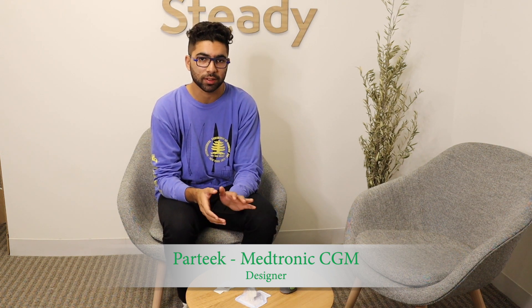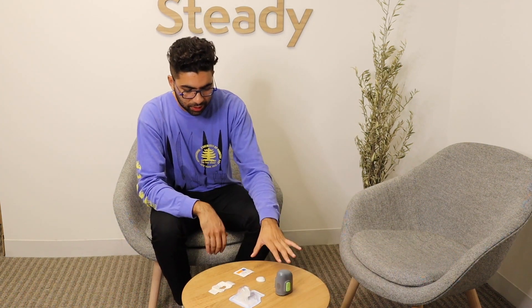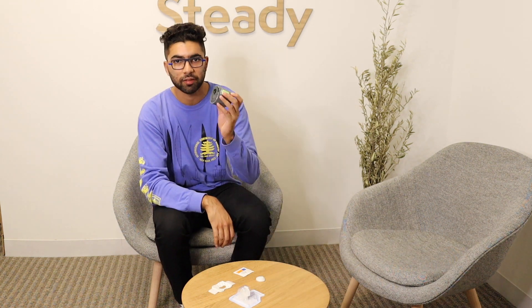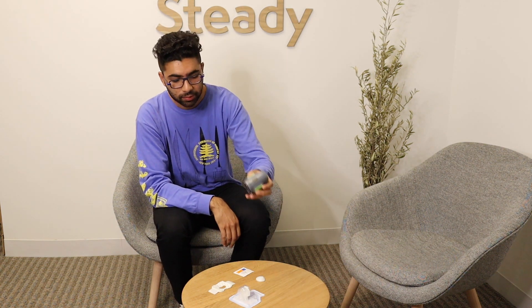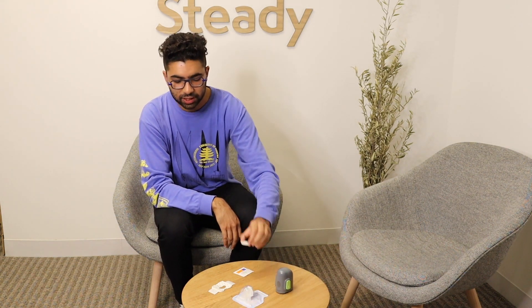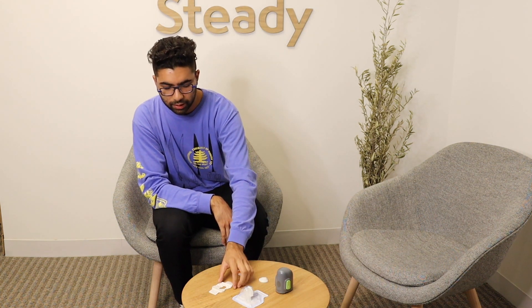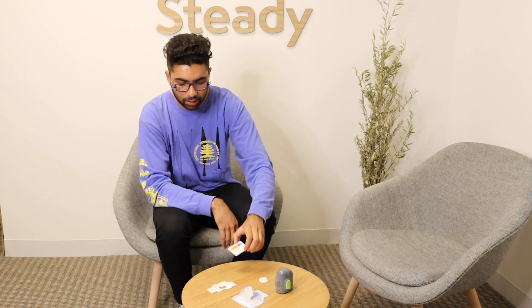My name is Partik and I'm going to show you how to get set up with the Medtronic CGM. These are the pieces you need: the inserter, which is used to actually insert the sensor; the sensor itself; the transmitter that will connect to the sensor; the overtape to keep everything in place; and IV prep, which is used to prepare the skin site.